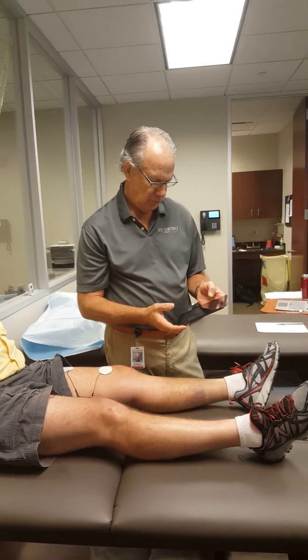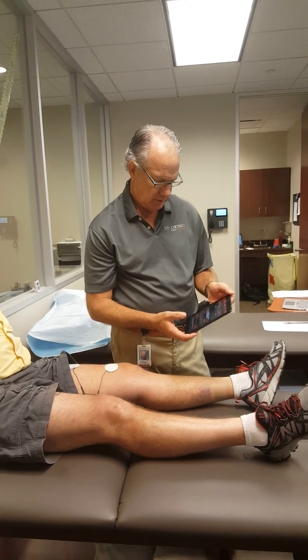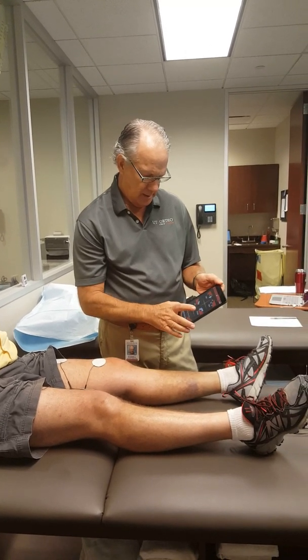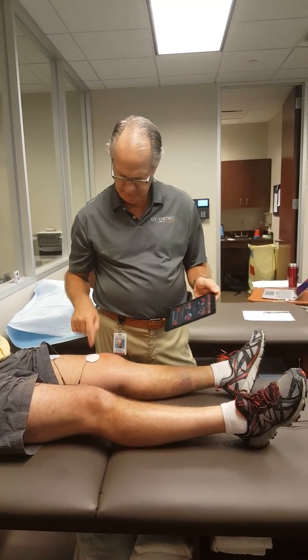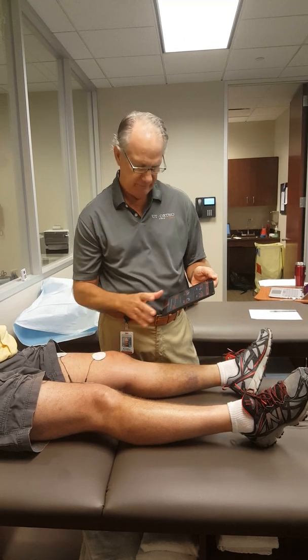We're going to show you how to do a neuromuscular deficit test here. We'll click on the Bluetooth. Channel 1 always goes to the involved extremity, so channel 1 is always the involved side, and that's the one that will be contracting first.